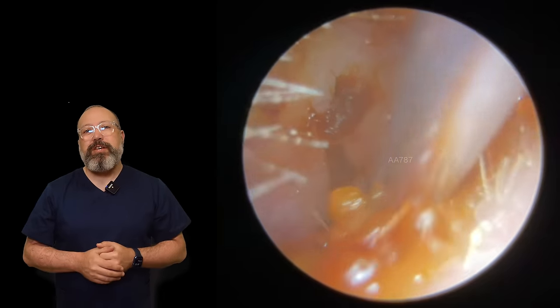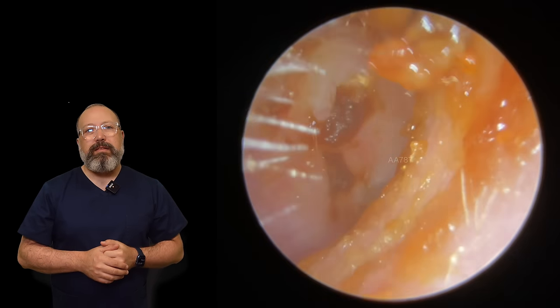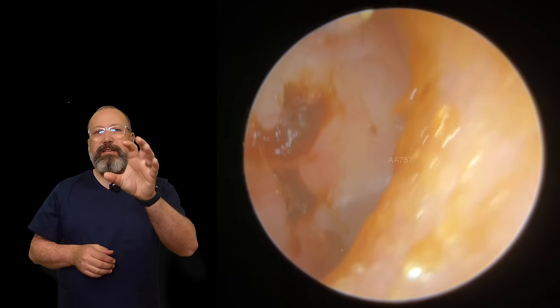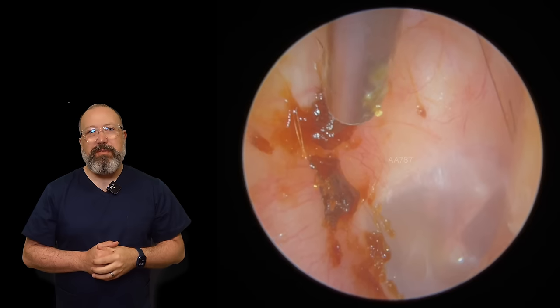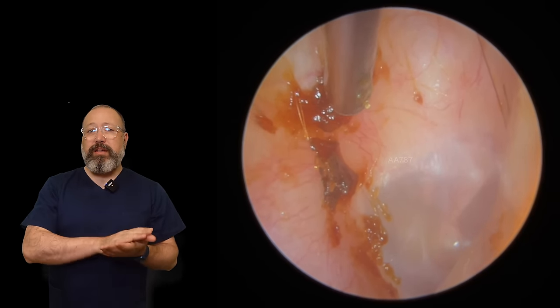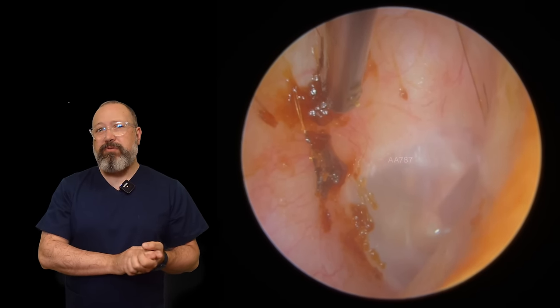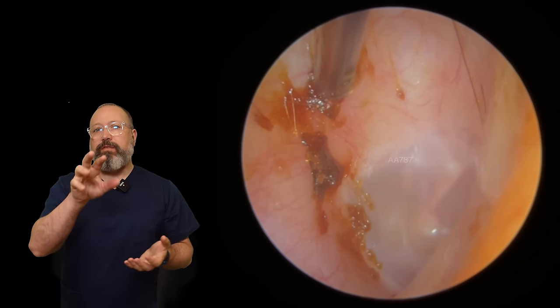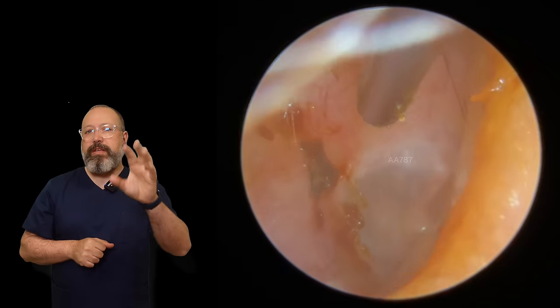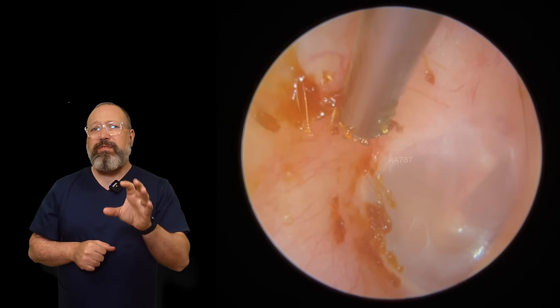You can see that kind of mushy layer — we're just going to do a quick once-over on the outer part of the ear canal. There's a little section to the top left corner we're going to start peeling. Super sticky bits now. There's a very thin bit at the bottom of the eardrum as well — it's so thin it's like oil. What I'd suggest is that next time the patient's in the shower, just give the ears a quick swill and it'll take those little pieces off.